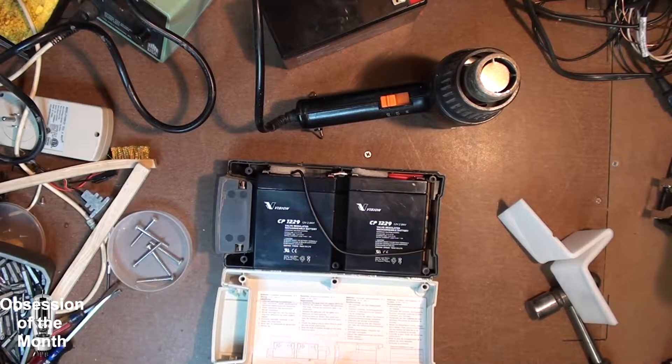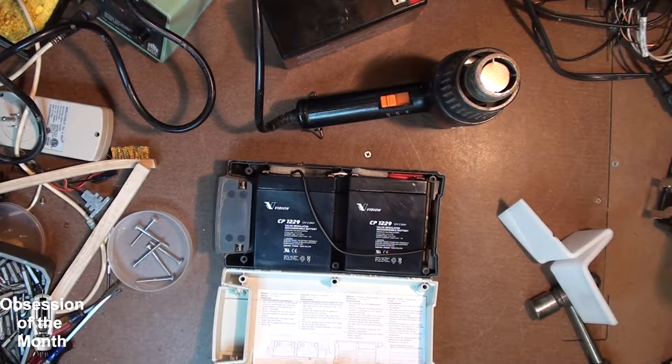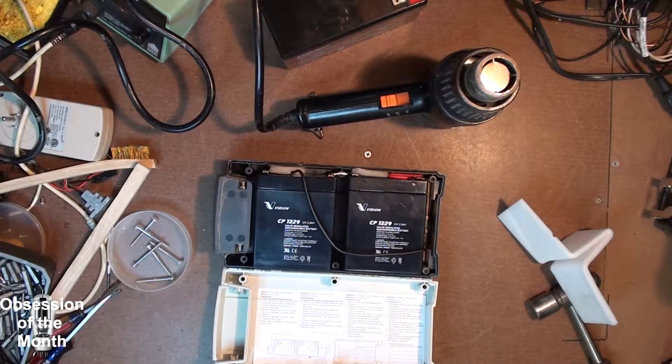It's two 12-volt batteries in series for 24 volts. What that means is I can order these batteries online and replace them. I can't wait to find out how much Linac wants for the batteries, but I'm pretty certain I can get these for really cheap.